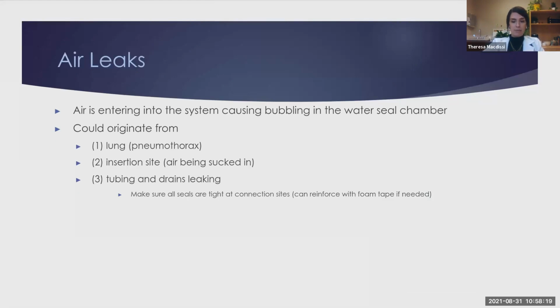So, air leaks. We've mentioned air leaks already a couple times today, but just to drive home the fact, an air leak is when you're looking in that water seal chamber down where the blue fluid is, you can see bubbling in that system.